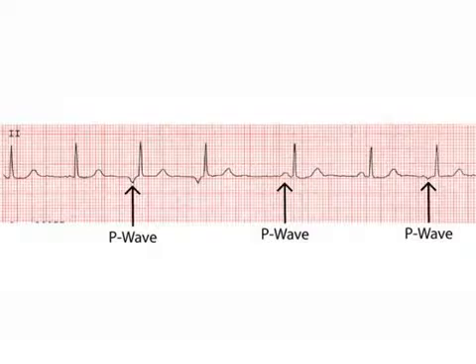And when this is faster, it's called multifocal atrial tachycardia, and it is a very common rhythm seen in COPD patients. So when you are admitting a COPD patient and it's an irregular rhythm, don't assume it's atrial fibrillation. Many times it may be multifocal atrial tachycardia, and that's treated much differently.